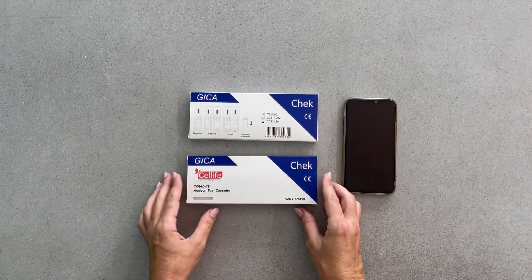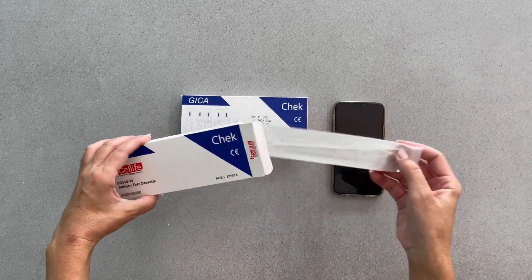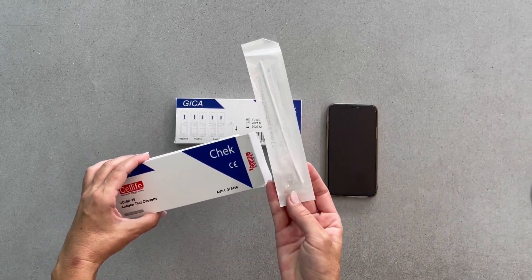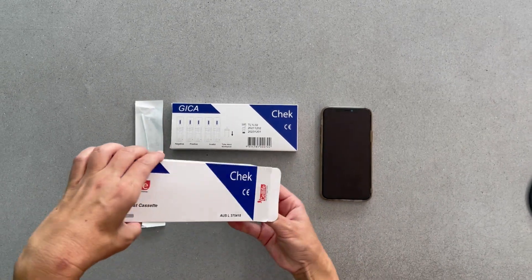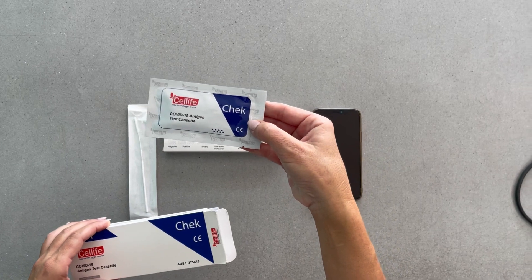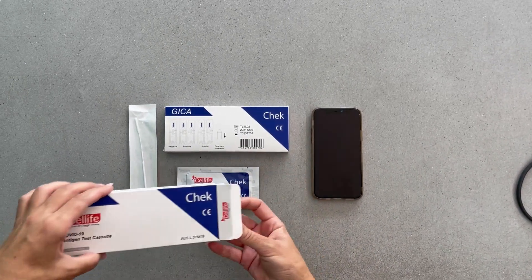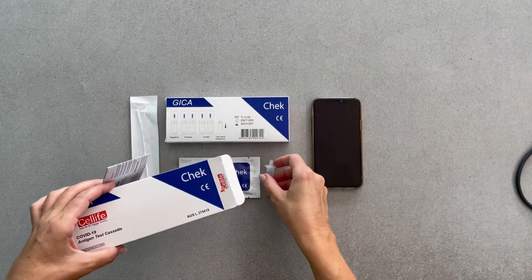CellLife Australia introduces our new COVID-19 antigen test cassette. Our easy-to-use kit contains a sterilised swab, a test cassette, and an extraction tube containing the buffer solution.